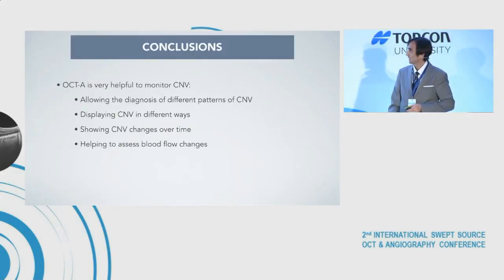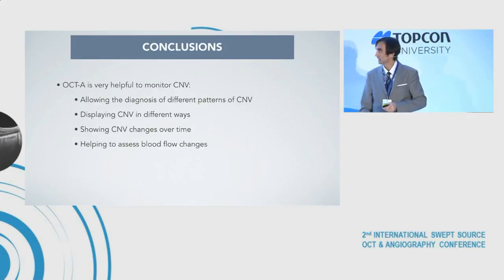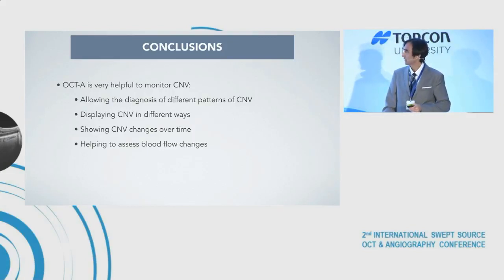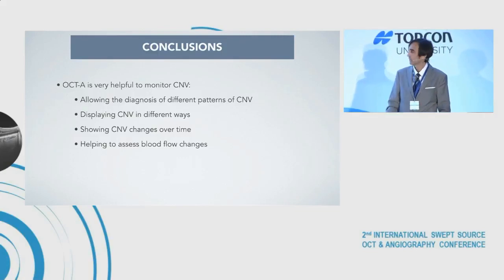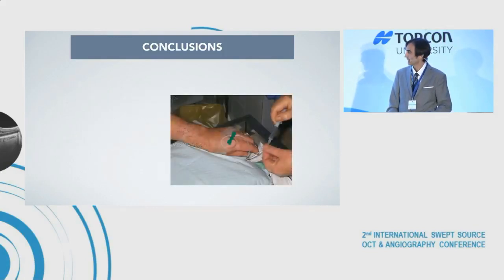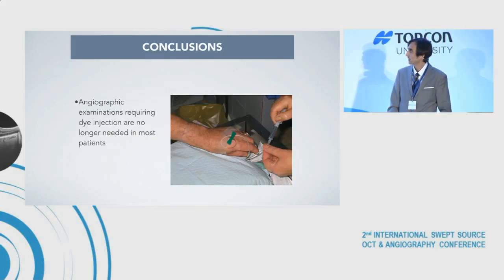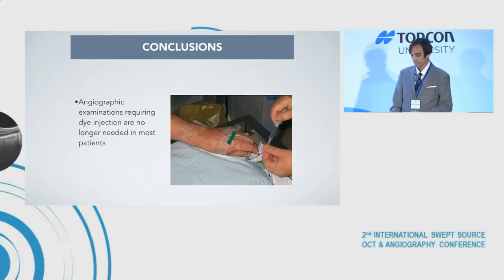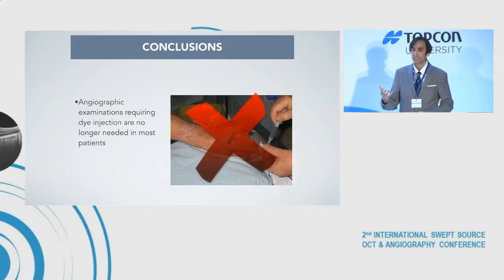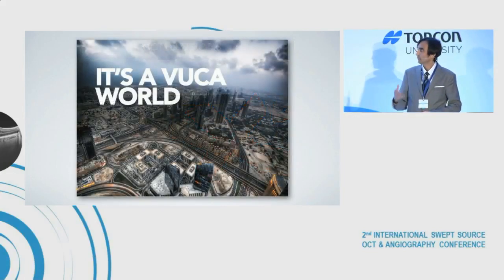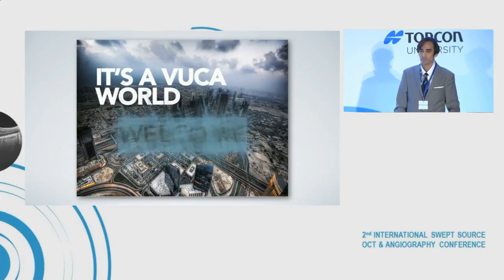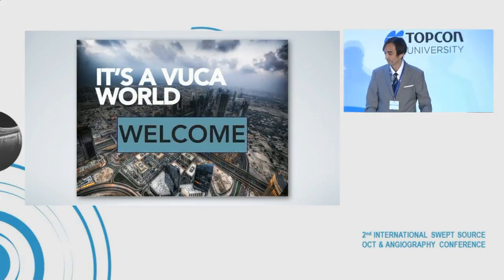To sum up, OCT angiography is very helpful to monitor CNV: allowing the diagnosis of different patterns of CNV, displaying CNV in different ways, showing CNV changes over time, and helping to assess blood flow changes. As pointed out before, angiographic examinations requiring dye injections are no longer needed in most patients. Remember that things are changing very fast — we are in a VUCA world. Thank you very much.